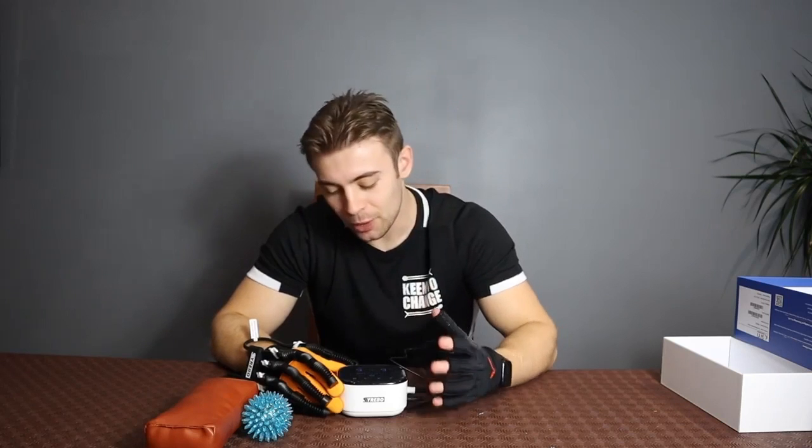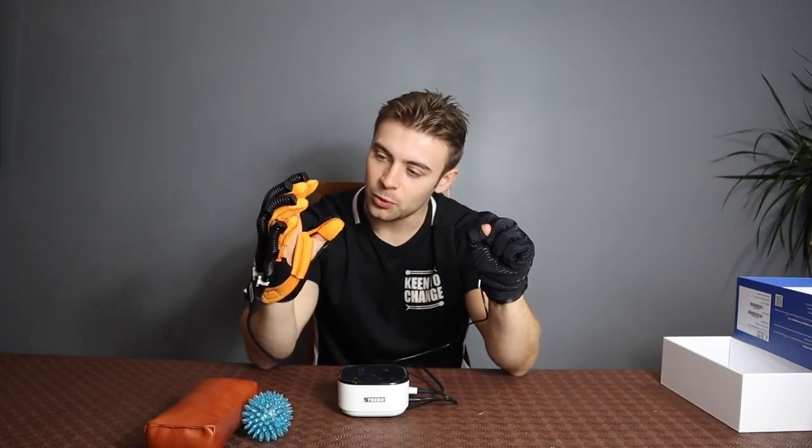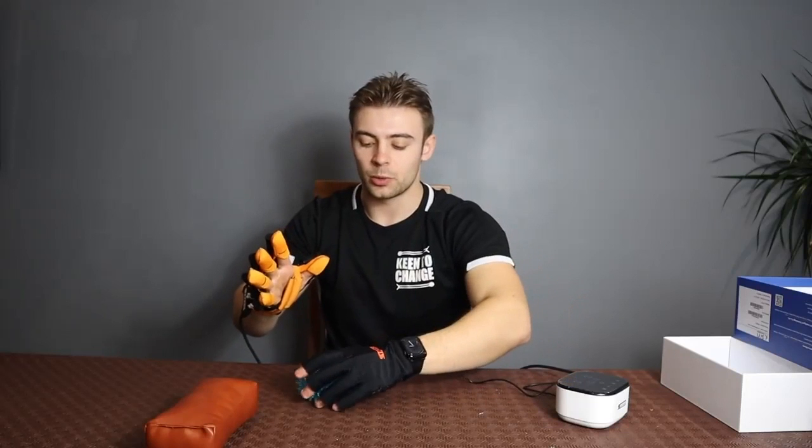Manual training is really great as it allows you to get your proprioception back — it allows you to get the feel of moving your hand again. With mirror training, as we've mentioned before, if I move this hand here, this hand will also simultaneously draw itself in, and if I release it'll also come straight back. We'll give you a proper demonstration just now.